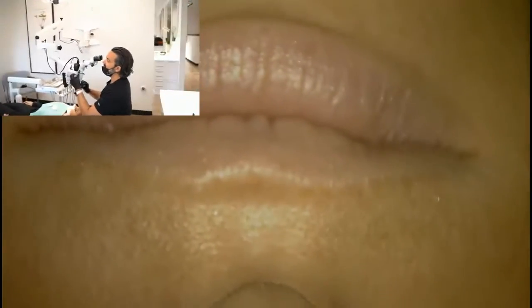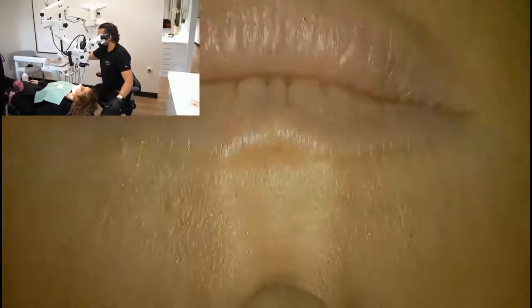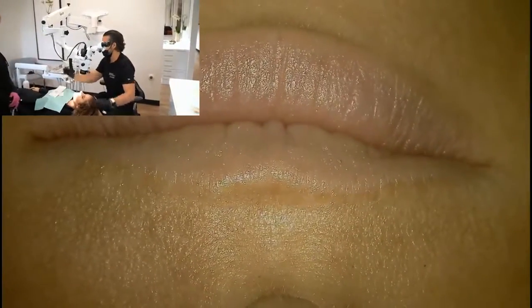So you start focusing first at high magnification, and then when you come down to low magnification, you can refocus a bit, and that's where you get into parfocaling. If I were to make this letter X here, it's easy to demonstrate what you're seeing.